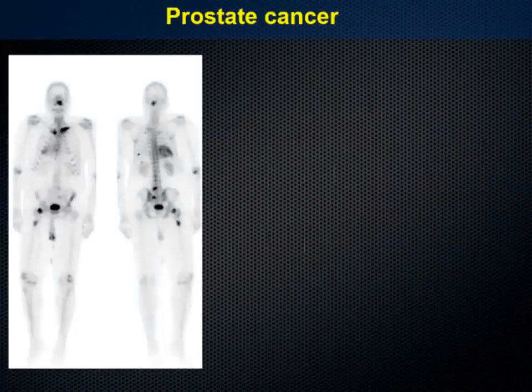This is a patient which came last week. I'm still waiting for the diagnosis. Multiple bone metastases. Is there anything you see other than the bones? Sorry? Uptake in the liver. Anything else? First I thought, yes, it's uptake in the liver.